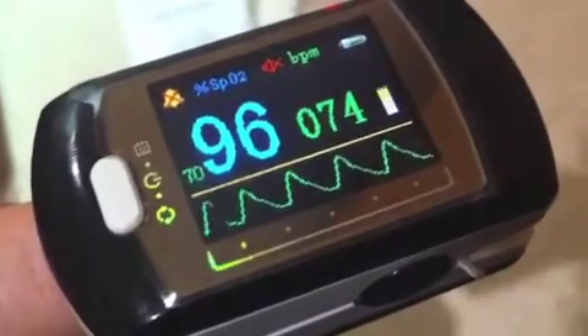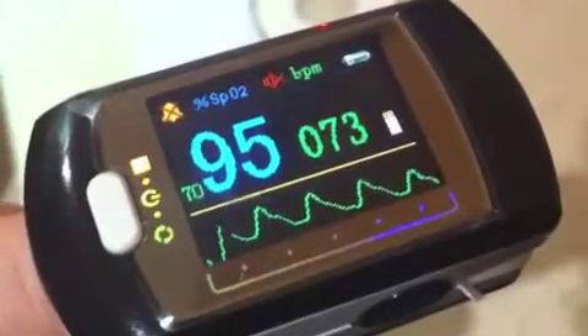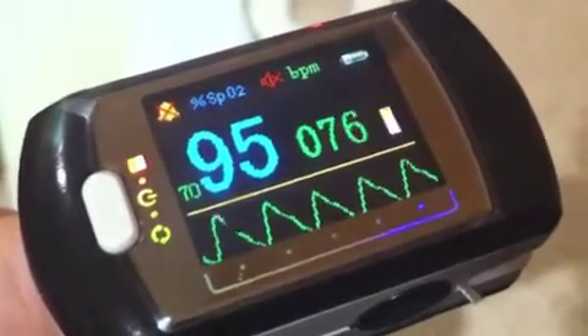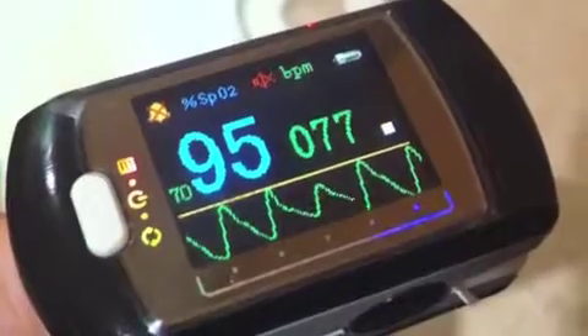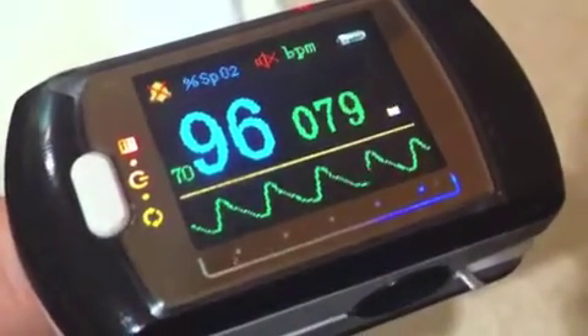I've popped the finger pulse oximeter onto my finger and switched it on by pressing the white button. These are the immediate readings. The reading on the left is the percent oxygen saturation — anything in the high 90s is reasonable. The smaller value on the right is my pulse rate.